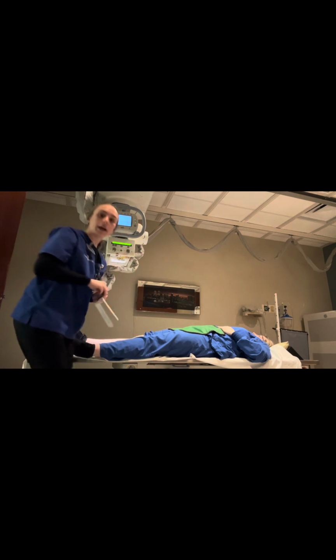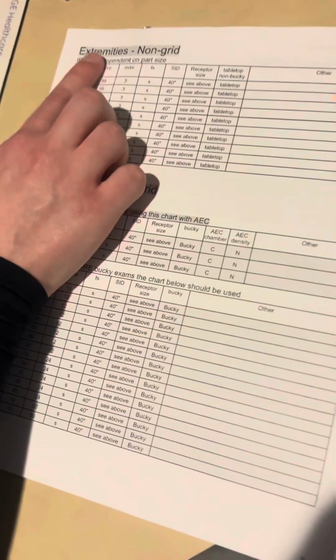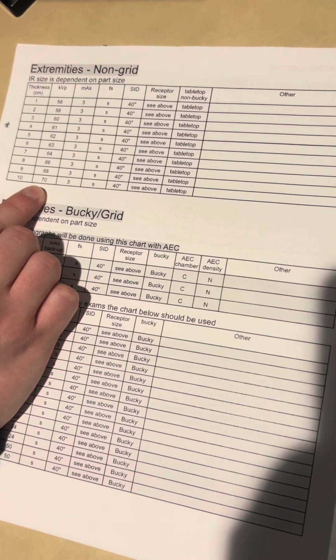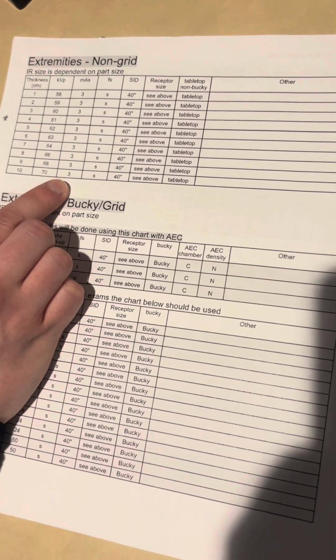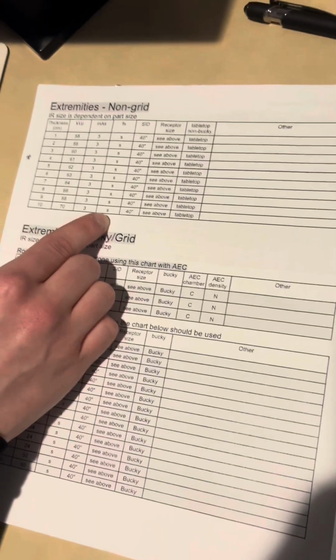So it looks like she's right at 10 centimeters. So Lexi, I'm going to have you hold still for me, okay? Okay, now that I'm behind this lead-lined wall here, I'm going to set the exposure factors. Since this is a tabletop exam, we're not using AEC. We're going to look at our chart here for extremities, and she was 10 centimeters in thickness. So our kVp is going to be 70, our mAs 3, and we are going to set a small focal spot because we are looking at bony detail.